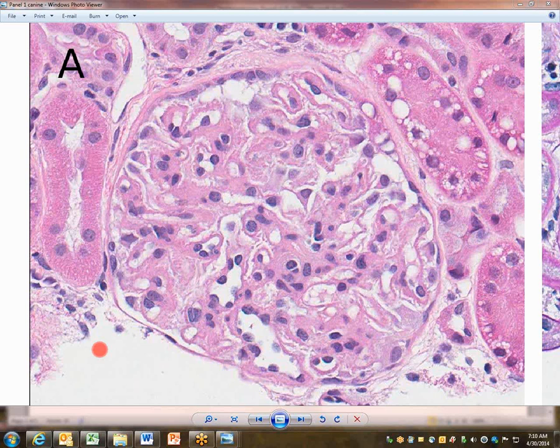This is Becca Conkin. I'm a first year resident at Ohio State, and I'm the only anatomic one here, so I'm doing this first panel. Looking at this glomerulus, I think the mesangium is multifocally expanded, with proliferation of mesangial cells multifocally throughout the glomerular tuft. I think there's some hypertrophy of parietal cells in Bowman's capsule, and there might be some synechiae, although it's kind of hard to tell on H&E. That was pretty much it for the H&E.